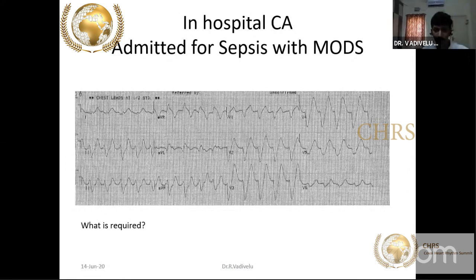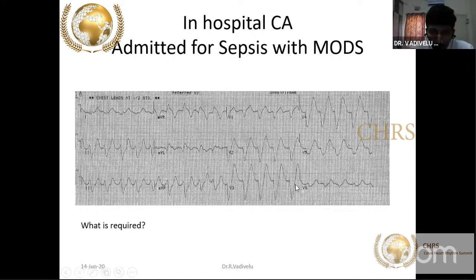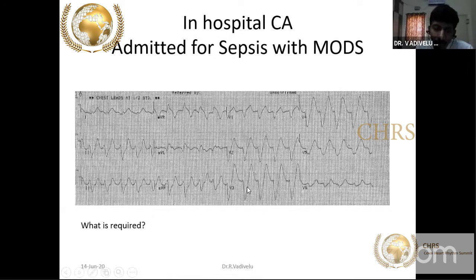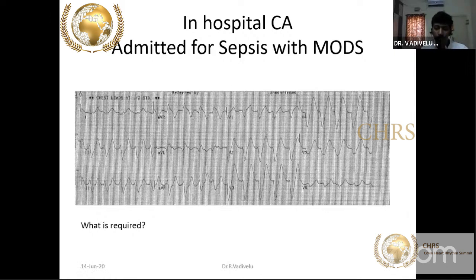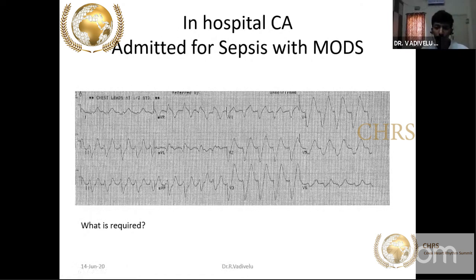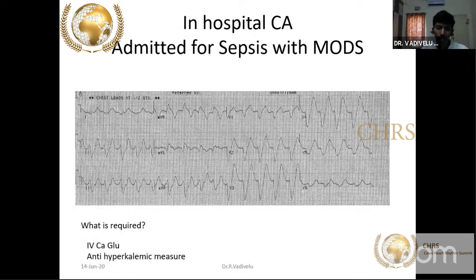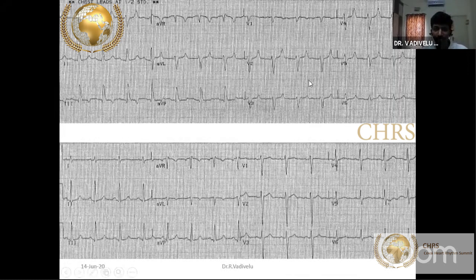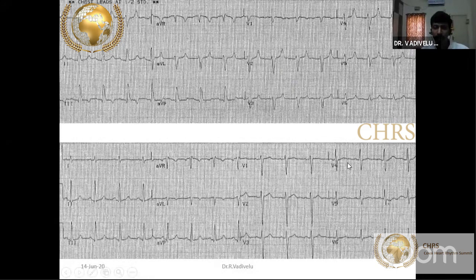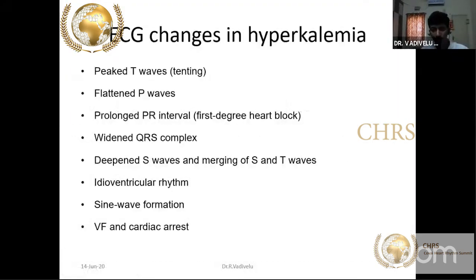Another elderly patient admitted for sepsis showing a wide QRS rhythm with no visible P waves and no distinct ST segment — QRS and T waves are merged, creating a sine wave pattern. When you see wide QRS without an ST segment, always suspect the sine wave pattern of severe hyperkalemia. Anti-hyperkalemic measures normalized the sine wave, then wide QRS, and finally the tall T waves. These patients should not be treated as LBBB with acute coronary syndrome.